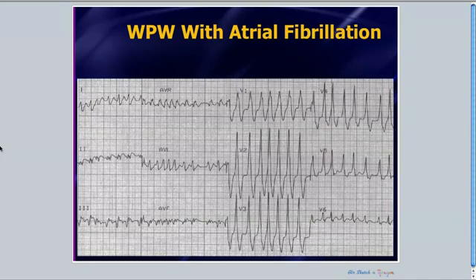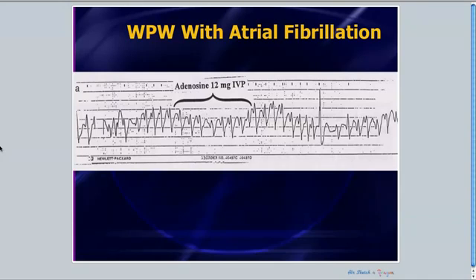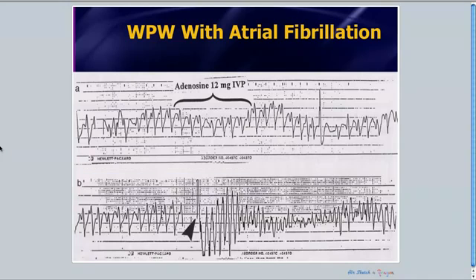All right, let's look at another example here. So this patient, if you glance at this, it kind of looks like VTAC, but look carefully, it's irregular. So this has to be AFib, and the rates are approaching in some places 300 beats per minute. The morphologies are changing. This is AFib with WPW, not recognized by the physician. It was a young person, so they decide once again to give some adenosine, a potent AV nodal blocker, and about 10 seconds later, the patient goes right into ventricular fibrillation.